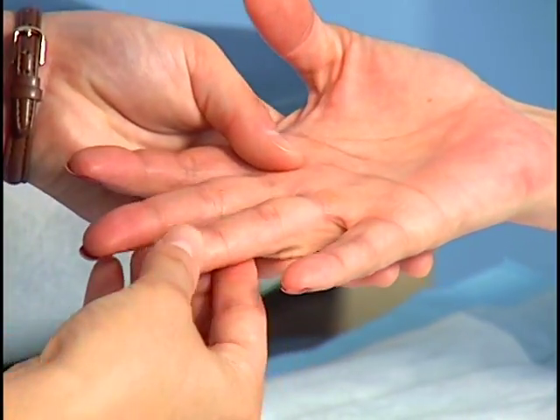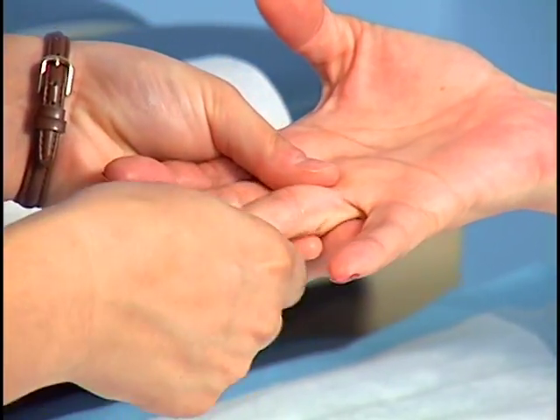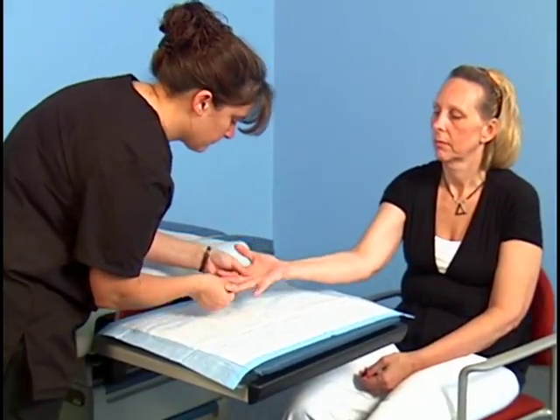Select an appropriate puncture site. Use the lateral part of the tip of the third or fourth finger of the non-dominant hand to make the puncture. If the patient's finger is cold, you can warm it by gently massaging the finger 5 or 6 times from base to tip. This increases blood flow to the area, which promotes bleeding from the puncture site.